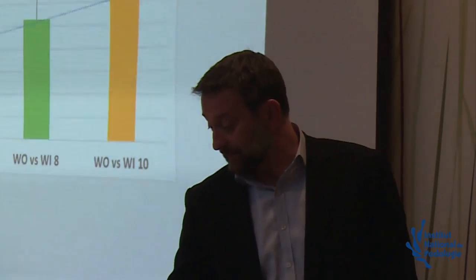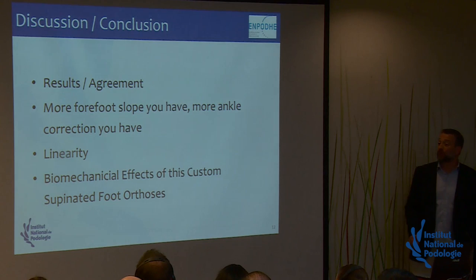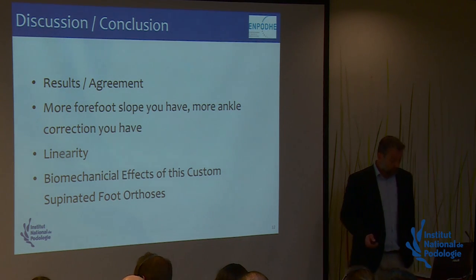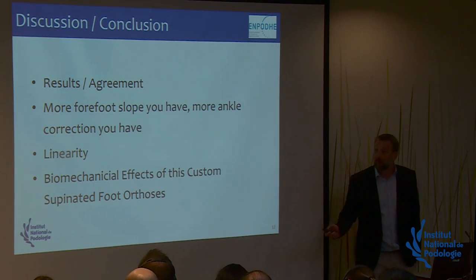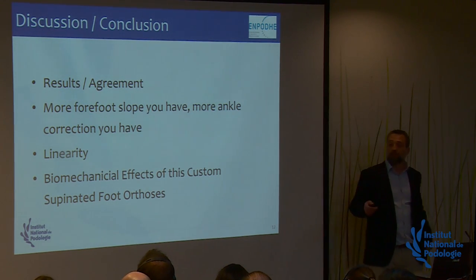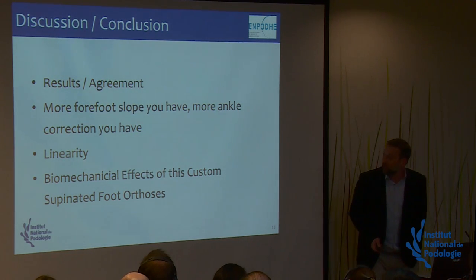So what does it say? Well, it says that supinated foot orthosis correct the peak eversion. And the more forefoot slope you have, the more ankle correction you have. What is very interesting is the linearity of the correction. Maybe we can think that with 3D printings or computers we can make our orthosis. There is a biomechanical effect of this custom supinated foot orthosis.